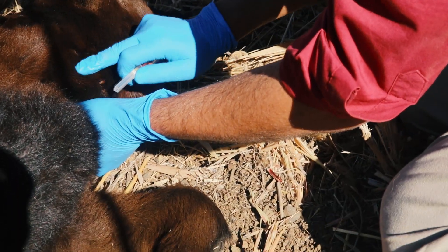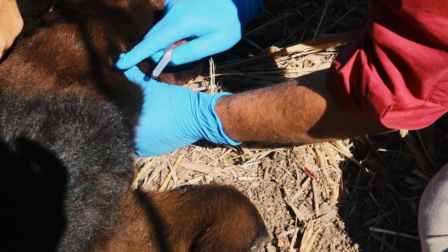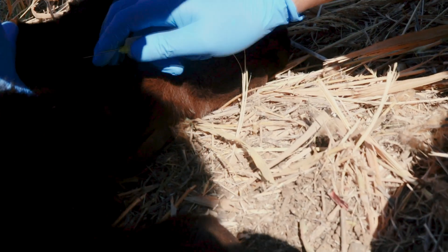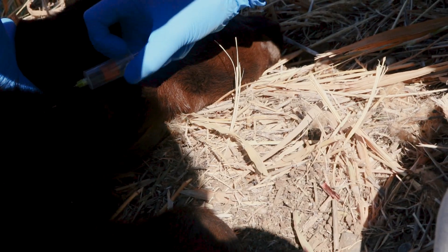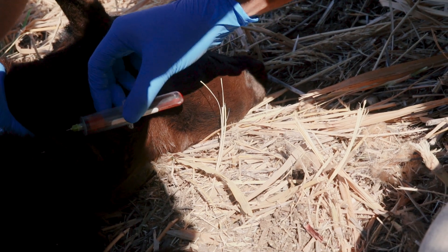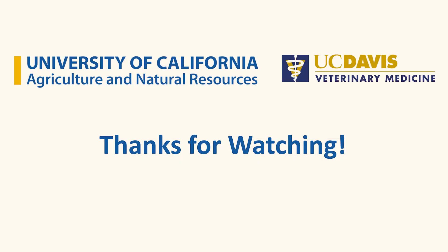Finally, you can also get a blood sample if the calf is recumbent — for example, if it has been restrained by a rope. The technique for blood collection is the same as in the other two scenarios.